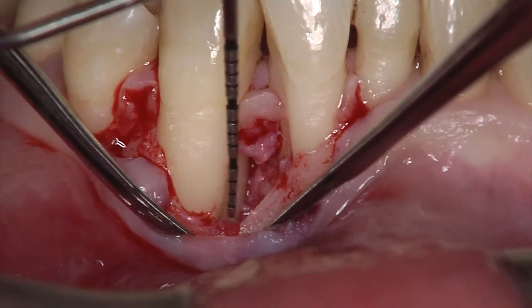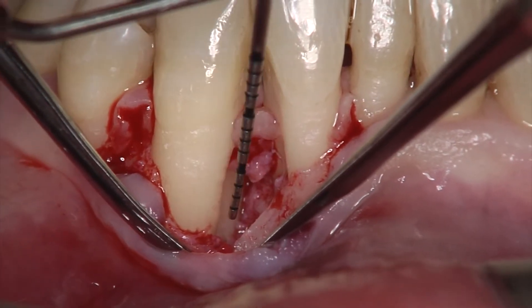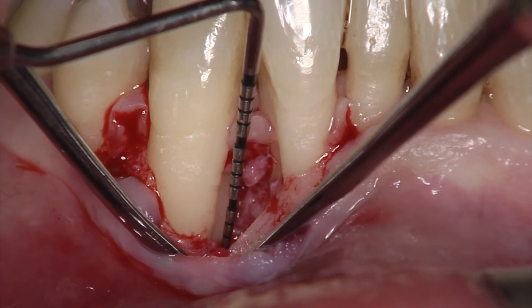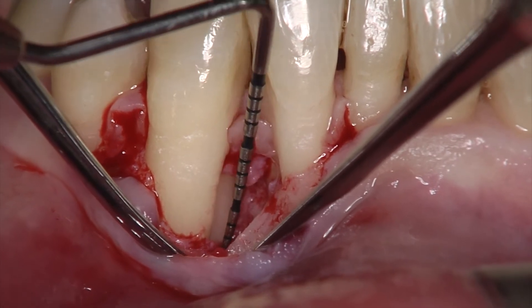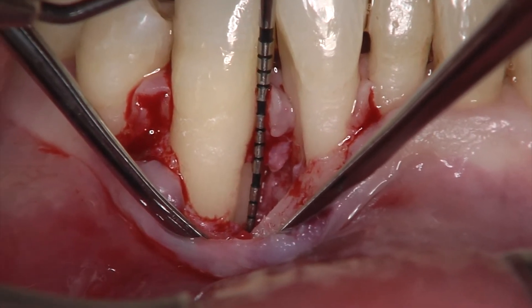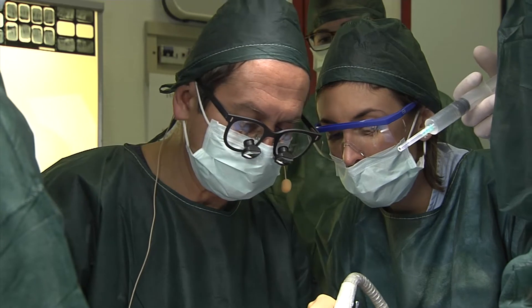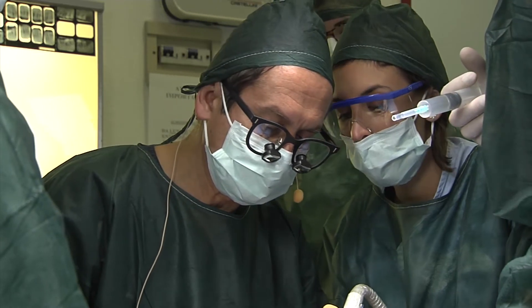The root surface is mechanically cleaned by an ultrasonic scaler. The defect appears as a one- to two-wall intraosseous non-self-containing defect.